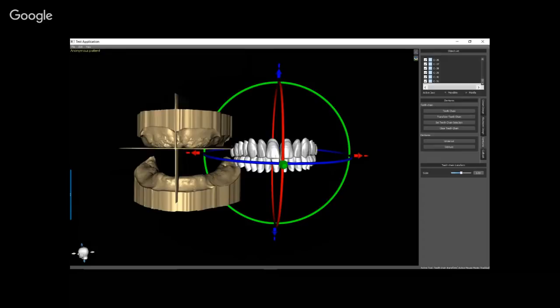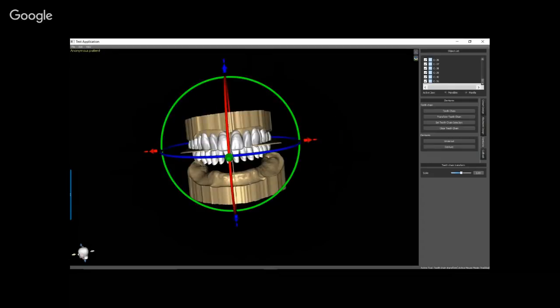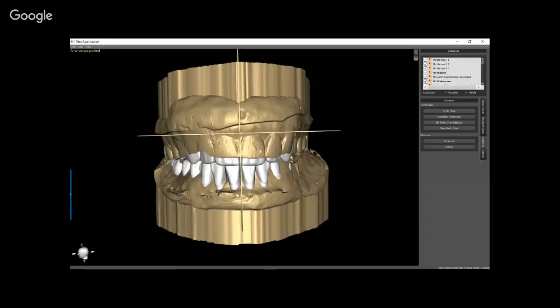So I choose the mold of teeth based on his facial characteristics and the size. There's a lot of different methods for choosing the mold of teeth, but I'm importing those upper and lower arches completely pre-occluded. I pull them in, and the first thing I'm doing is setting this parallel to that hip plane. Okay, so the occlusal plane of the teeth I'm importing is totally parallel to the hip plane.